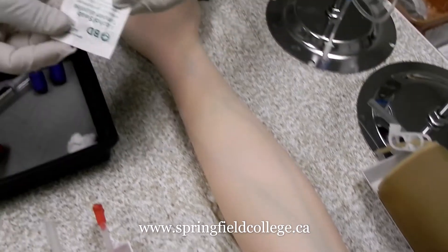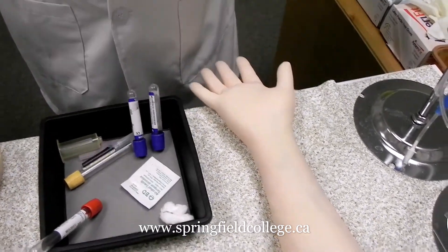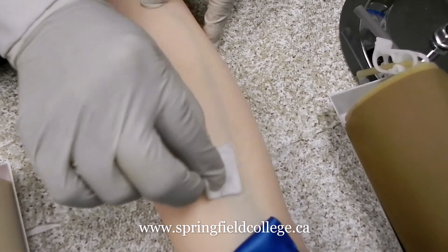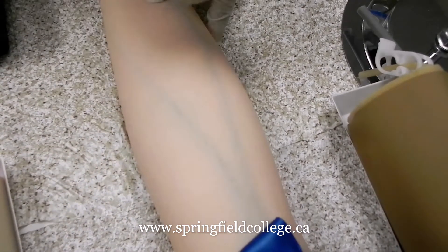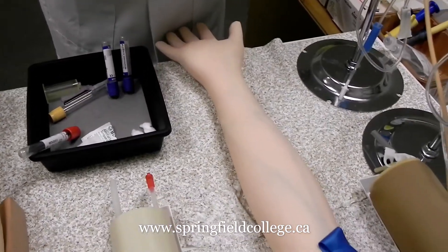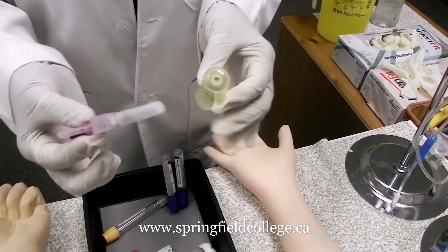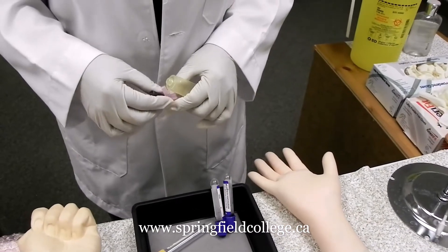After that we are going to open our alcohol swab and prepare the area. We go 30 seconds in a circular manner — 30 seconds preparation and 30 seconds drying. This is a very important part to remember: never blow dry, and never attempt puncturing in a wet condition. By the time the area is getting dry, take the most important components — always check that before you start you have all your supplies in proper place.